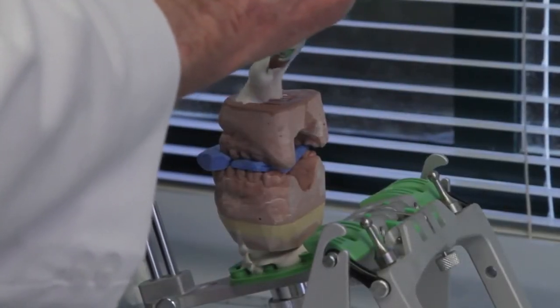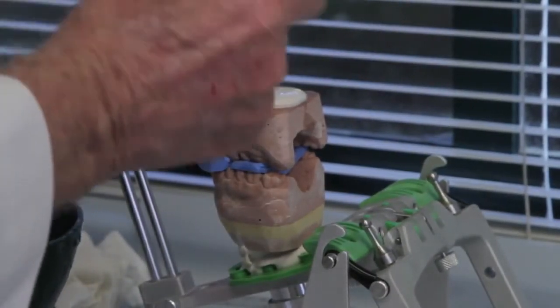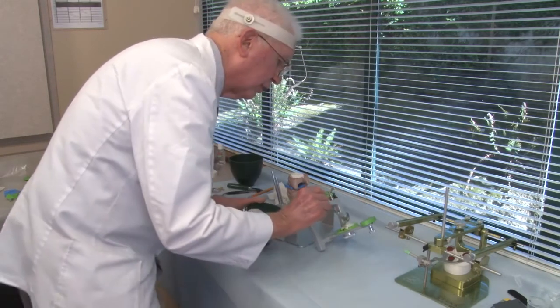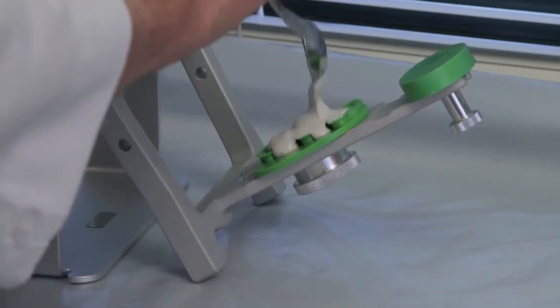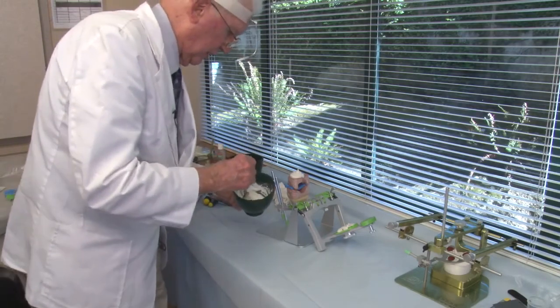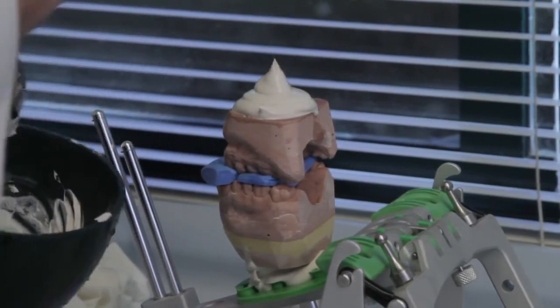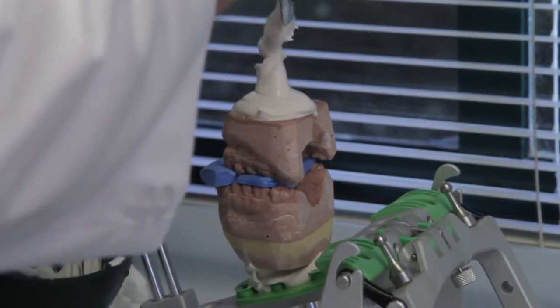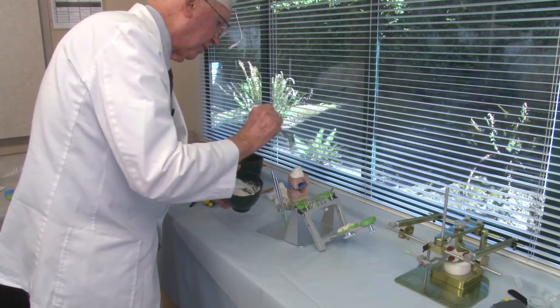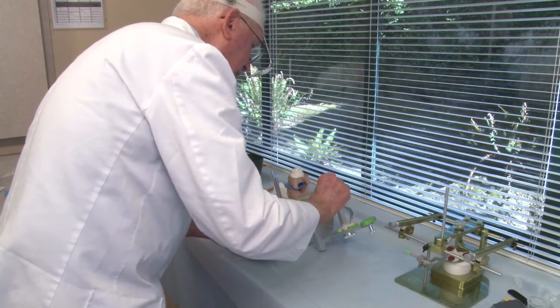And I want to make sure it works into the retention grooves that I have. And then add a little bit to the lower mounting plate. And again, work it into the retention grooves. Now when you do a lower model like this, there's a large amount of space. As I close the articulator, it'll tend to push the excess plaster forward. So I have to be ready to catch the excess plaster and wipe it off and not let it drop down onto the models. So it's a little bit of a problem you have to watch for.